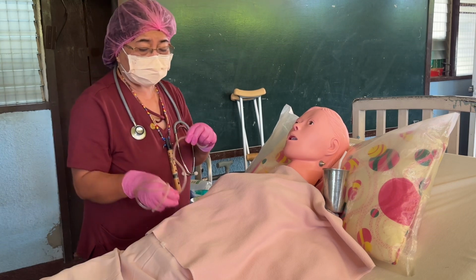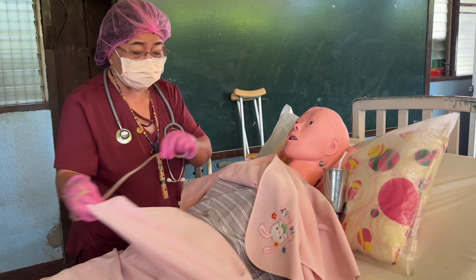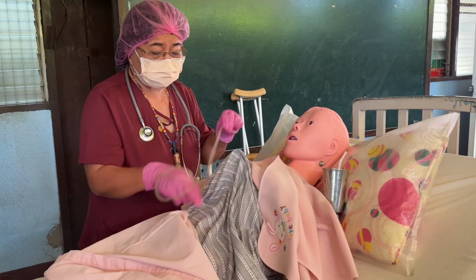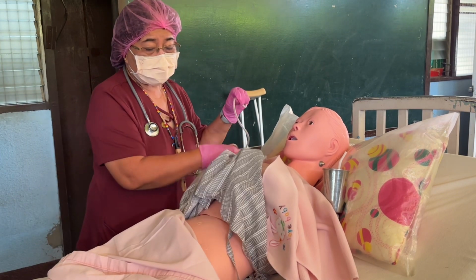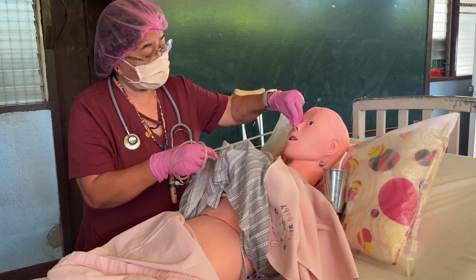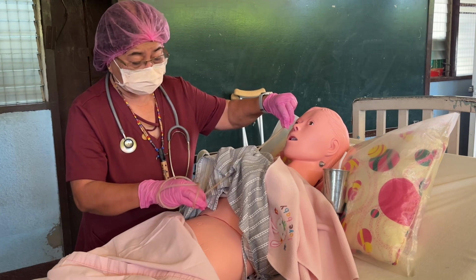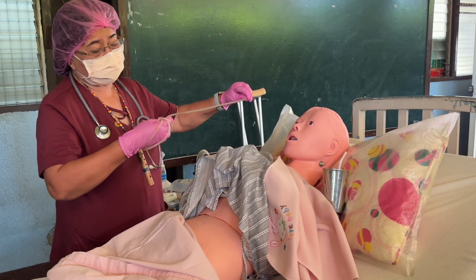If you cannot see it, you can as well remove the covering, no? So this is a clean technique, class. So you can pull. It's not sterile. It's only clean. So medical asepsis. Nose to the xiphoid process, then advance at least 2 inches. Okay, that's the stomach.